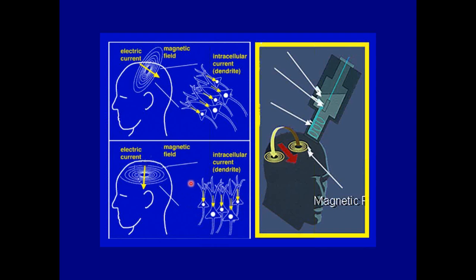If, however, the neurons are orthogonal to the skull or scalp, the magnetic field circles around and around within the head and really never exits. So MEG is insensitive to sources that are radial, but very sensitive to sources that are tangential. So these fields are then recorded by the MEG system itself, which has pickup coils and a very sensitive device called a SQUID that can record these minute magnetic fields only if it's superconductive, so it has to be immersed in liquid helium.